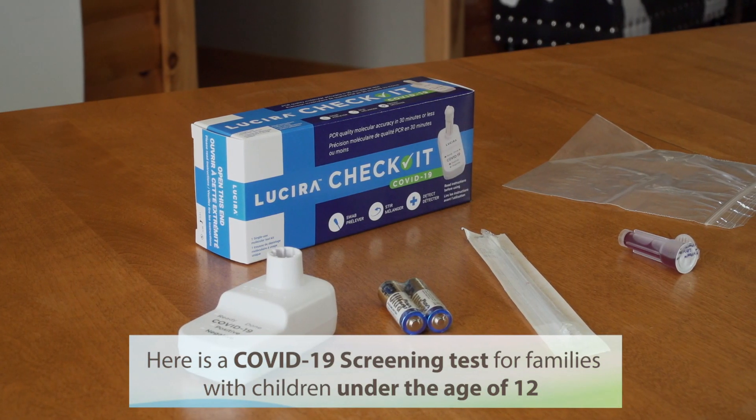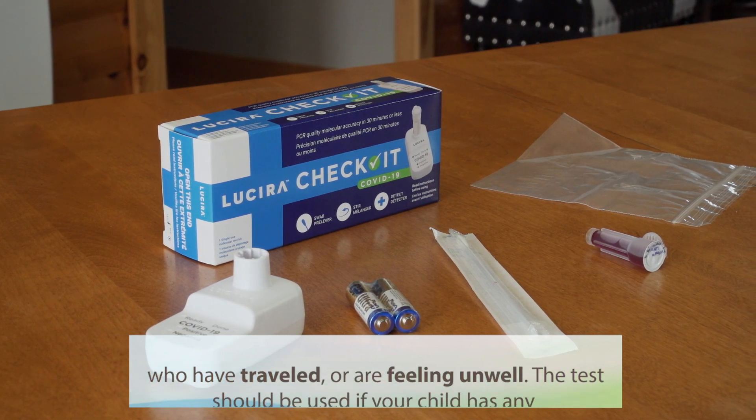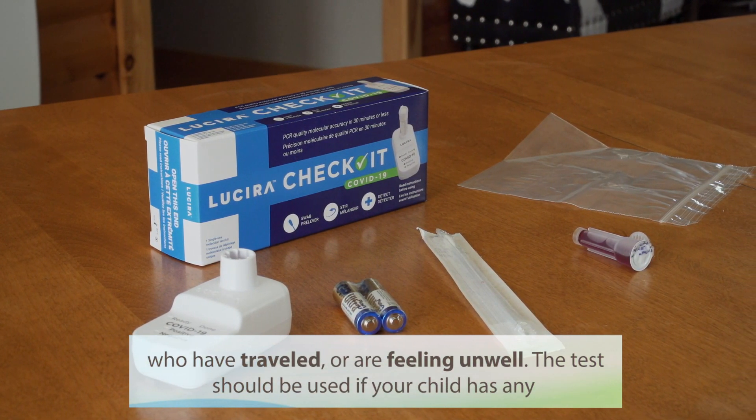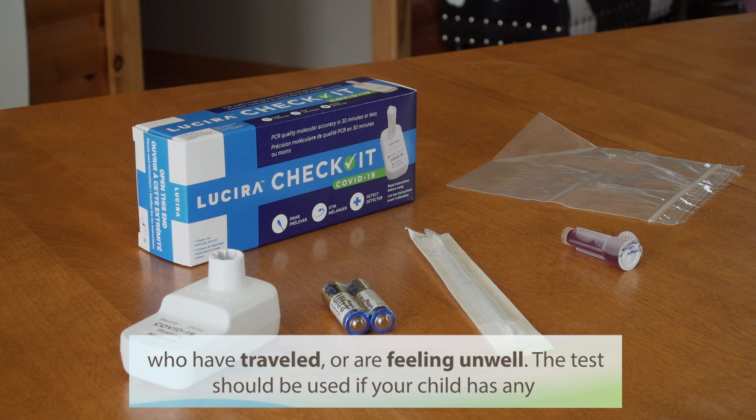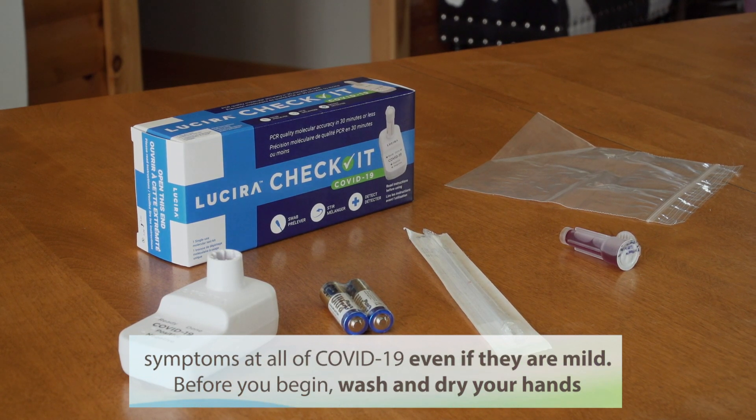Here is a COVID-19 screening test for families with children under the age of 12 who have recently travelled or who have been feeling unwell. The test should be used if your child has any symptoms at all of COVID-19, even mild ones.